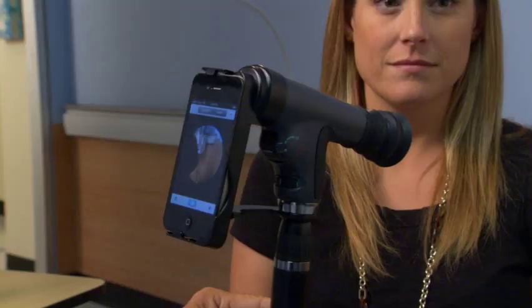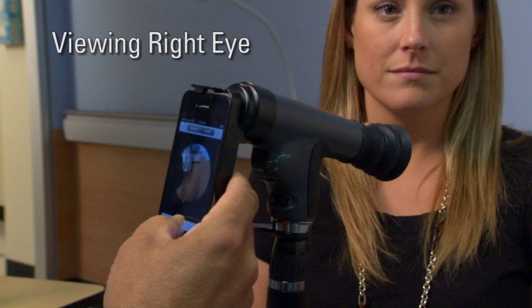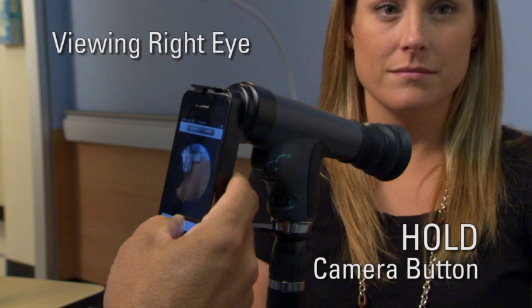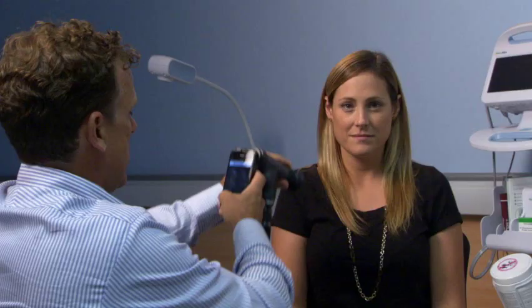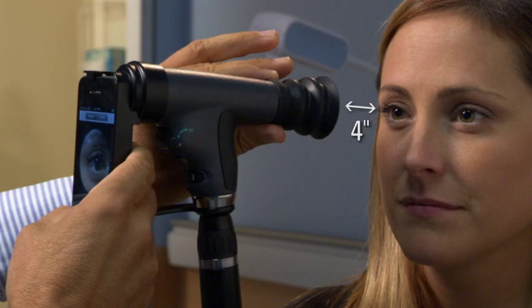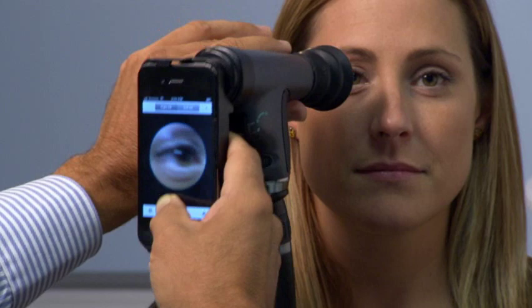For best results, use the device in a dimly lit room and try to have the patient looking towards a dark or shaded area of the room. For viewing the patient's right eye, grasp the support arm between your index and middle finger of your right hand and use your thumb to touch and hold the camera button on the iPhone screen. Don't remove your thumb until you're ready to take images. With your left hand, grasp the end of the scope nearest the patient eye cup between your thumb and index finger. Sit opposite the patient and hold the Panoptic approximately 4 inches away from the patient. Position yourself at eye level with the patient and instruct the patient to look over your shoulder at something on the back wall. Direct the illumination into the patient's eye at a 15 to 20 degree angle on the temporal side.